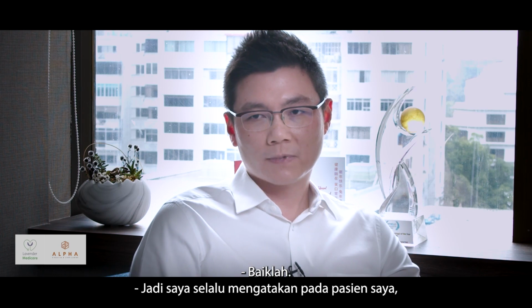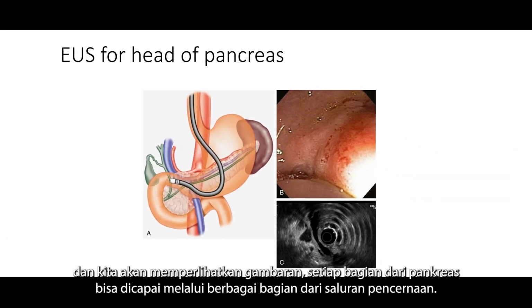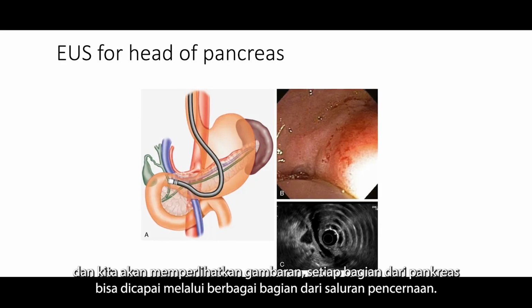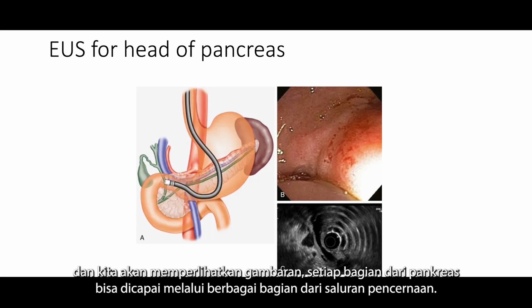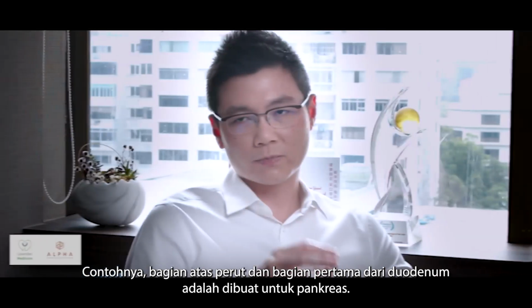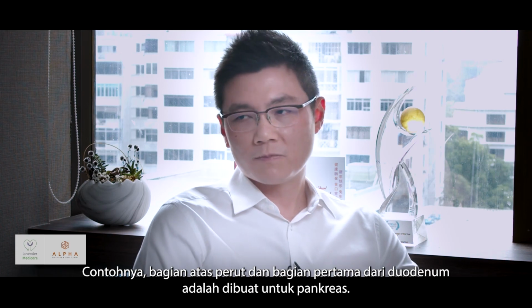So I always tell my patients EUS is tailor-made for the pancreas, because if you look at the anatomy, and we'll show you pictures, every part of the pancreas can be reached via different parts of the digestive tract. For example, the top of the stomach, the end, the first part of the duodenum. It's just made for the pancreas.